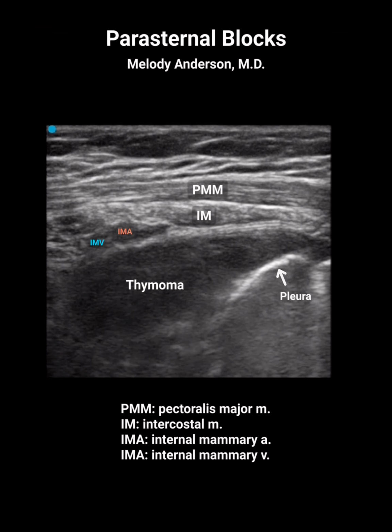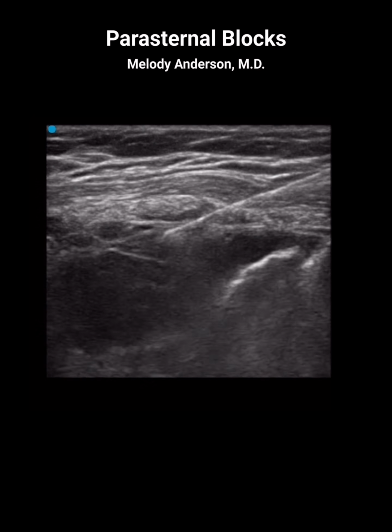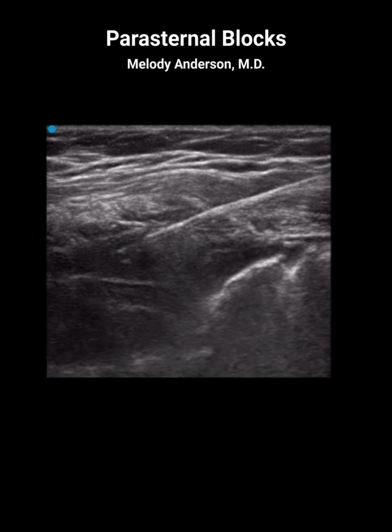The deep approach is an advanced technique. Careful hydrodissection with in-plane needle visualization at all times is recommended to avoid injury to the mammary vessels and pleura.